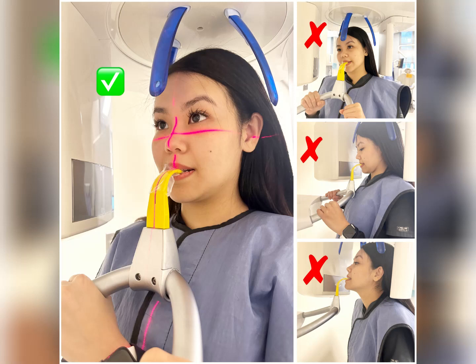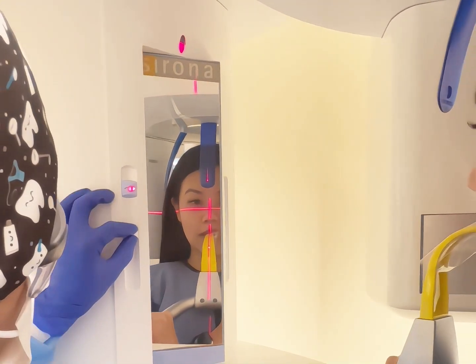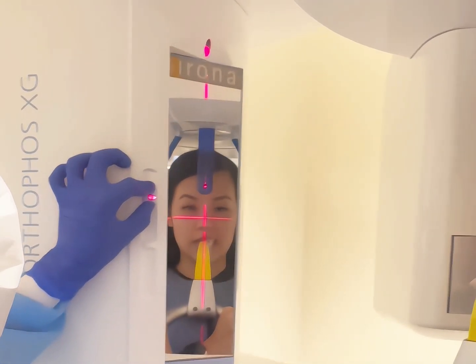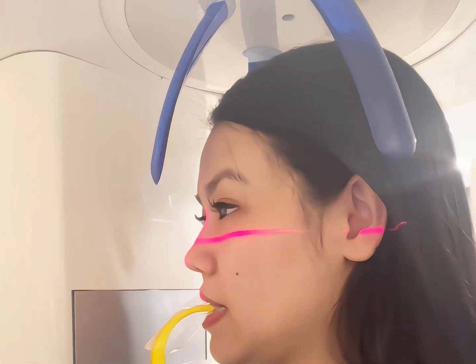Therefore, we should tell them to look straight ahead, and please note that the patient can keep their eyes open, since patients tend to move more, lose balance, and feel uncontrolled when they close their eyes. To make sure the patient's position is proper, the clinician will pay attention to the lights that show two planes, which can be seen in the mirror on the machine. But please make sure that the light does not get into the patient's eyes.